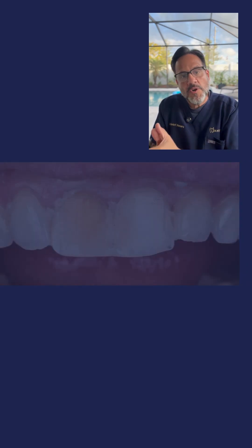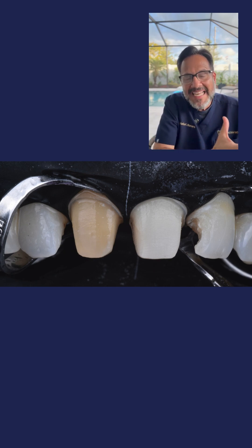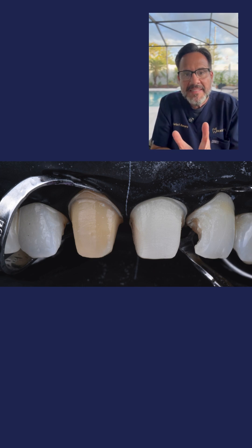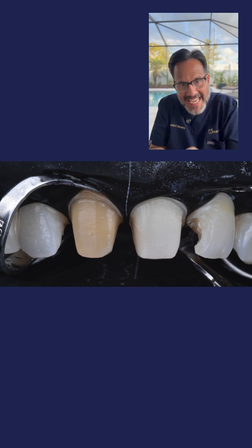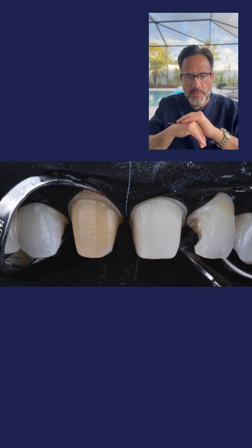So now let's go to photo number five. In photo number five, I have completed the preparation of both teeth, eight and nine, and I've completed also the immediate dental sealing of both of these substrates. Right after that, we're going to remove the rubber dam. We're going to scan these teeth, and we're going to send them to the lab for the fabrication of the final restorations.